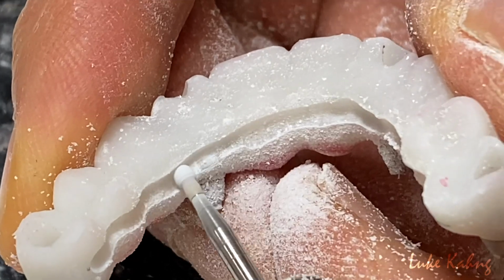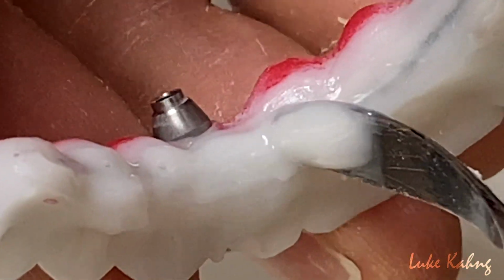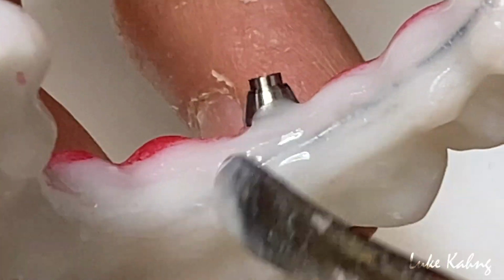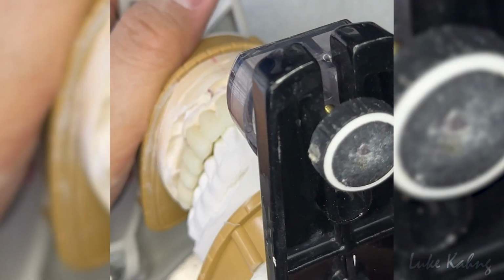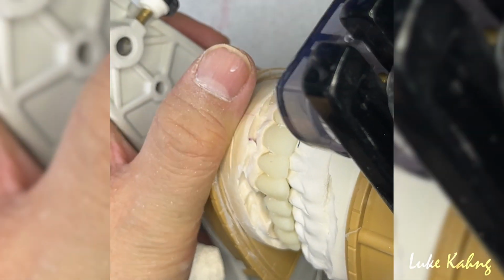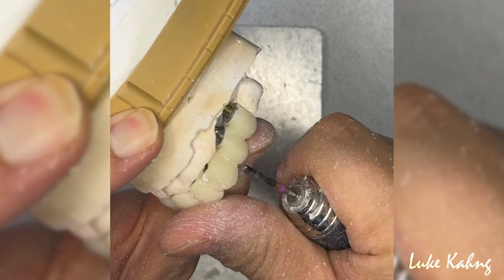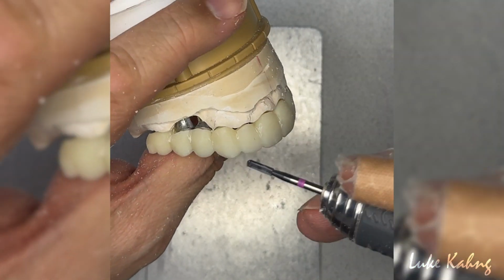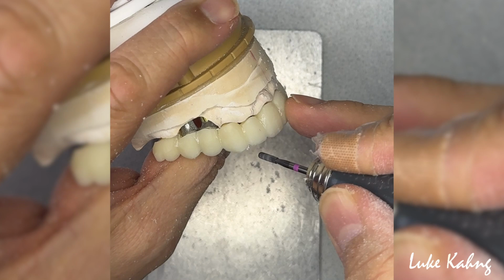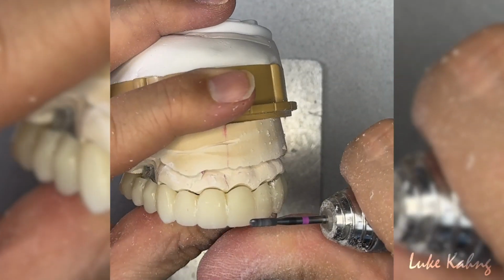And the other tip is this one is a long span, as you can see. So we recommend wire in the back side, and then we cut it and put it all the way. Here's the most important thing. See my videos, occlusion forces. Occlusion forces are not only the bite and chewing, we have to see all the movement, that will be better. The reason I can explain this kind of full mouth restoration, like I said, is very imperative. Provisionally, we're not going to be perfect, but we prepare for hygiene, longevity, aesthetics, the contour, those kinds of things. That's why I would like to share with you guys.